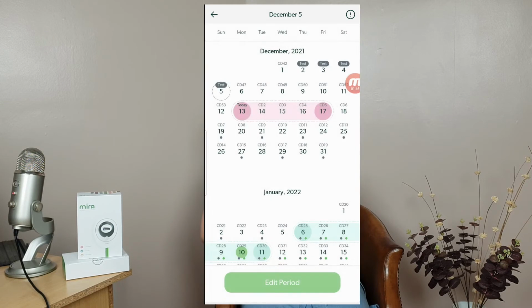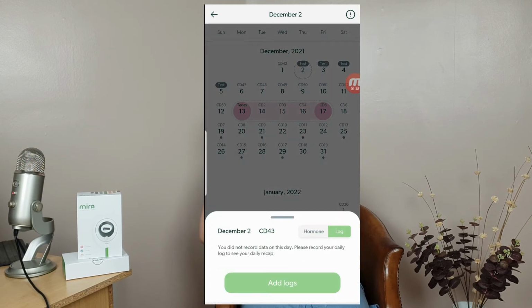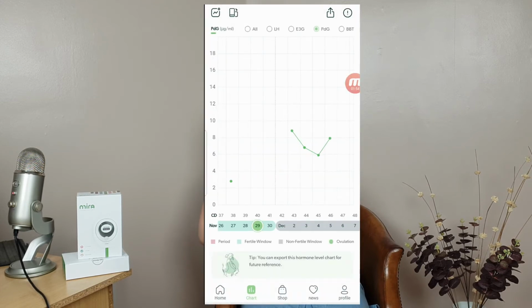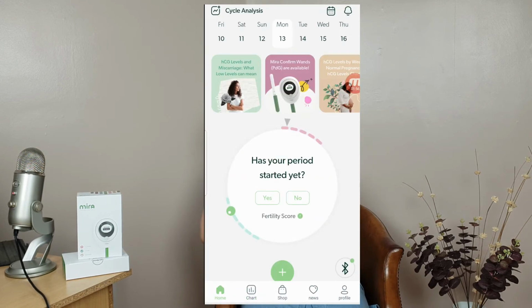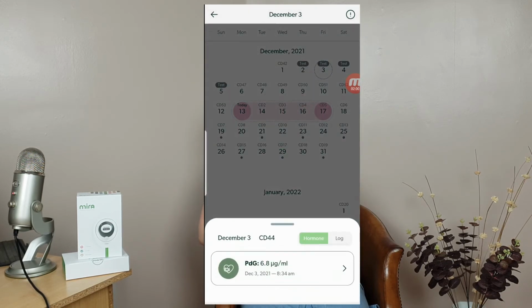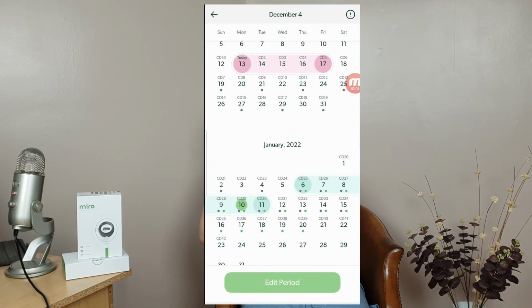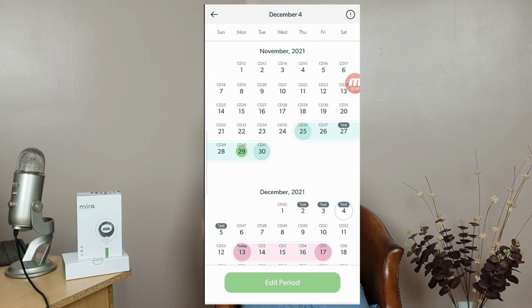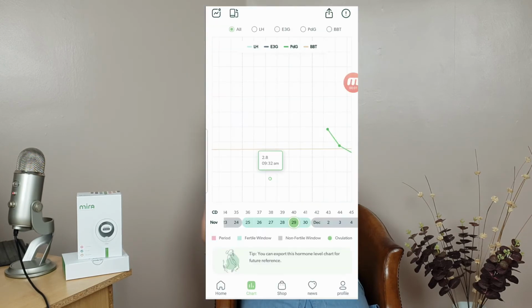Ovulation is determined based on a series of PdG data points. Testing during the fertile window allows the app to recognize your individual PdG levels that lead up to and follow your ovulation. The app will utilize its data to better predict and confirm ovulation for future cycles. They follow on to say that generally you can start PdG testing on the first day of a fertile window, which is 5 to 6 days after your period ends, to establish your baseline, and then 5 to 6 days after the surge to confirm ovulation.